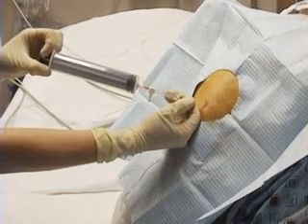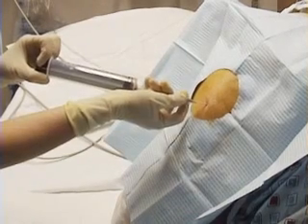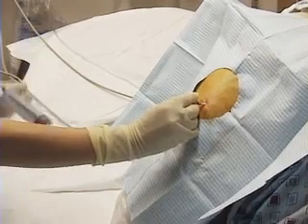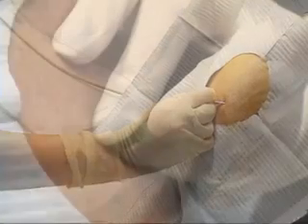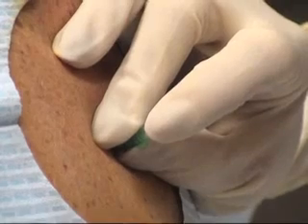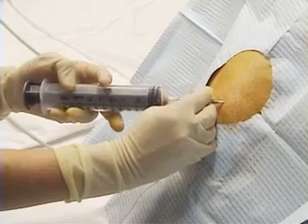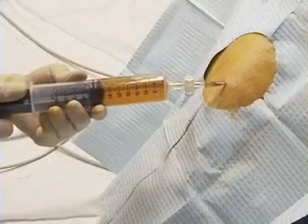Once fluid is aspirated, immediately stop advancing the needle and guide the plastic catheter over the needle. When the catheter is fully inserted, remove the needle as the patient exhales or hums. The exposed hub of the catheter should be covered immediately with your finger to prevent the entry of air into the pleural space. Next, attach the three-way stopcock and large syringe to the catheter and continue to aspirate fluid.